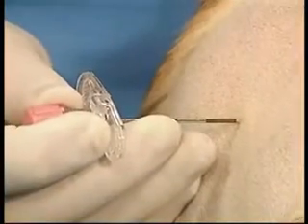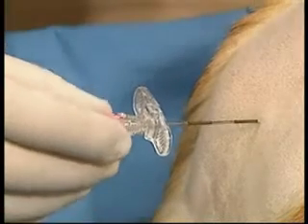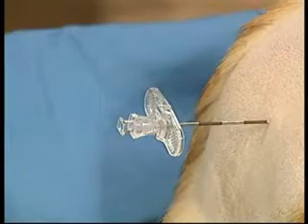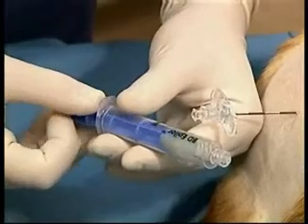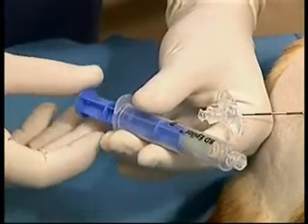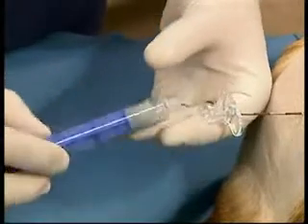The needle is then advanced until the epidural space is penetrated and the stylet is removed. The hub of the needle is inspected to ensure no spinal fluid is seen. Air is injected into the needle to ensure it's in the appropriate location. A specially designed Teflon-coated syringe is provided in the kit that has no resistance to the passage of air.